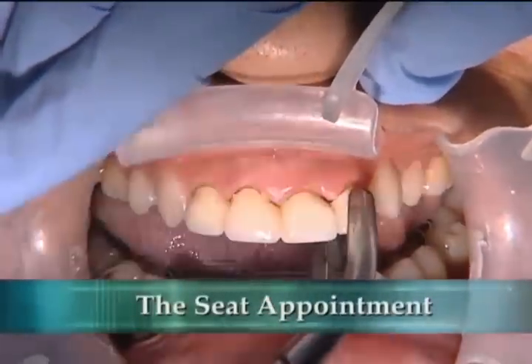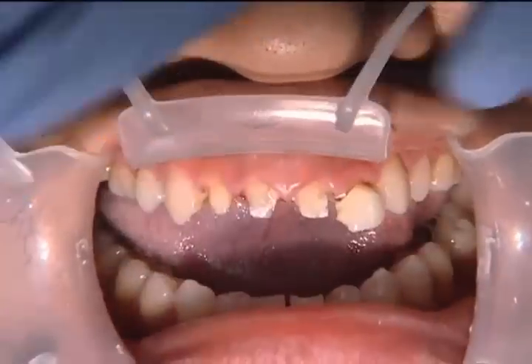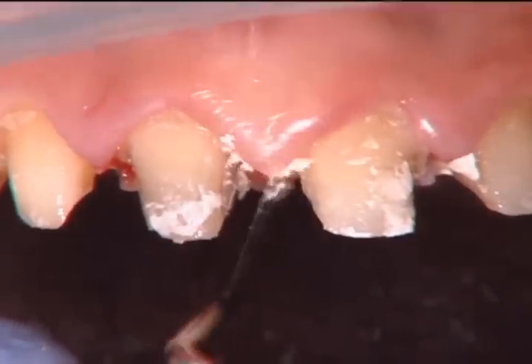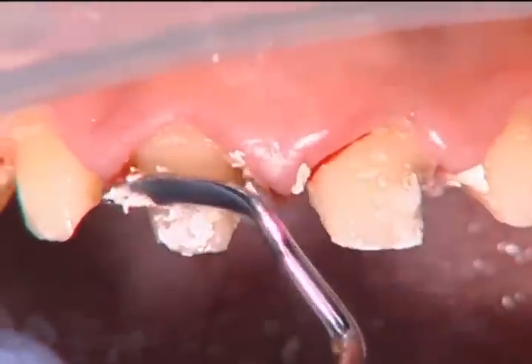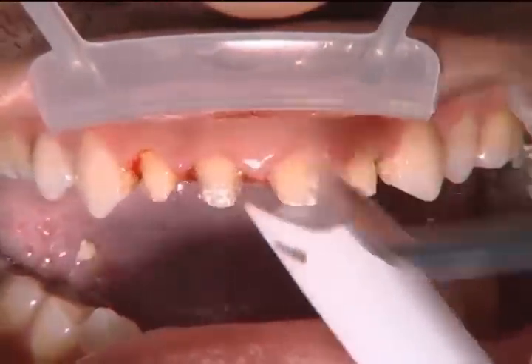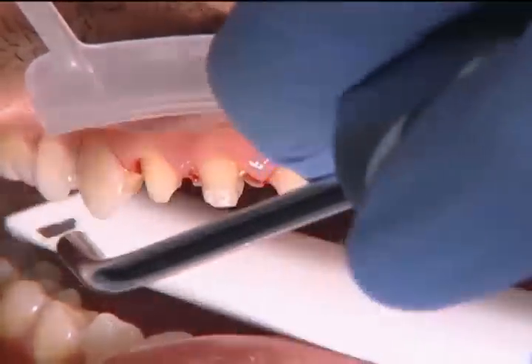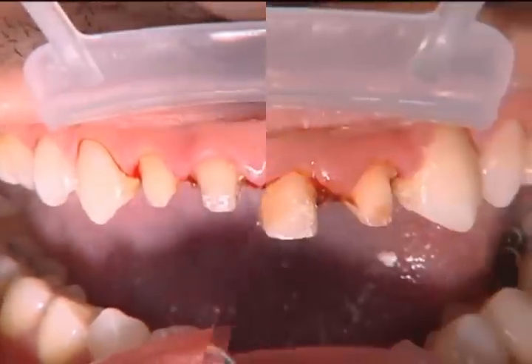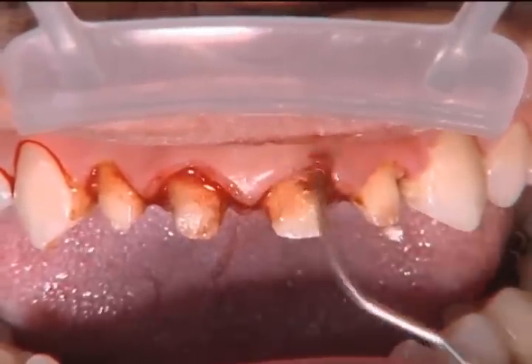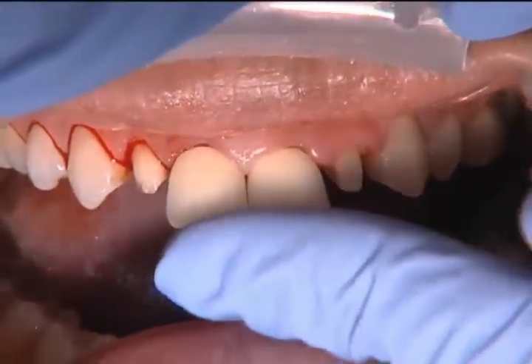It's been two weeks since we took the master impression, and we're removing the BioTemps — we cracked one right there. Now we remove the temporary cement from the teeth; Temp Bond cleans up really easily, though it can stick a little more over composite buildups. Some dentists put a little glycerin or Vaseline there to prevent that, or you can use the Kavo sonic scaler. This patient does not have the healthiest gum tissues — he's diabetic, and it's something he struggles with — so we're using Viscostat on the gingival because we have some bleeding.